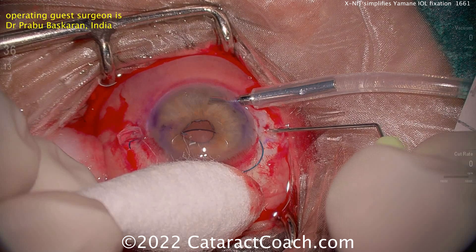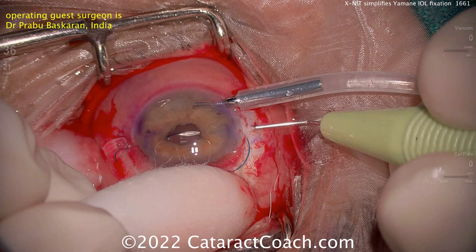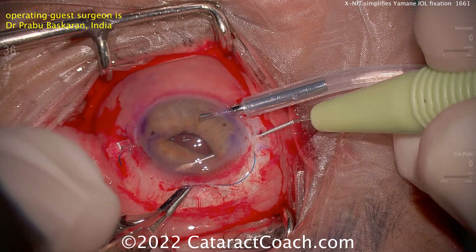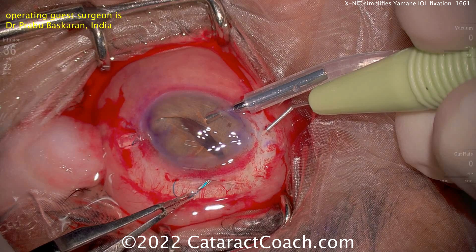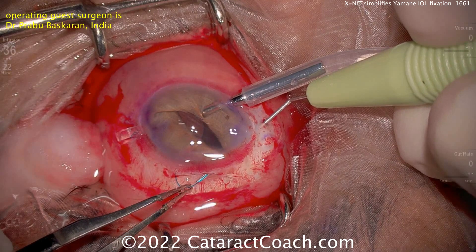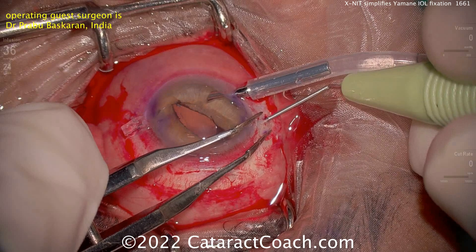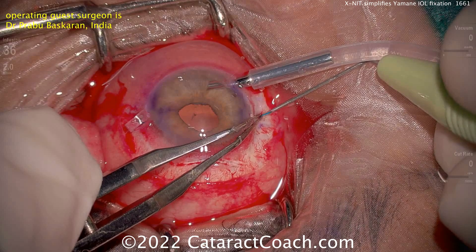Now the same thing on the other side. Here comes the needle again, going up through the pupil and out the main incision. The IOL is sitting just behind the iris at this point. Bringing the needle out, you can push it across and bring it outside the eye just a little bit, then feed in the other haptic. The first haptic is being held in place by that collar. You push the second haptic down the barrel of the hollow bore needle, then it can be very cleanly extracted. Look at the optic of the lens — it's staying planar and right behind the iris.